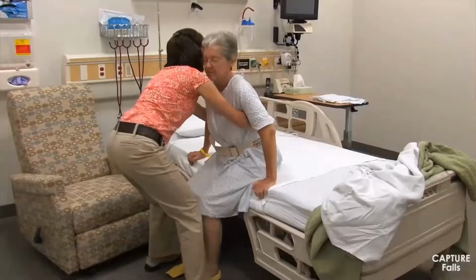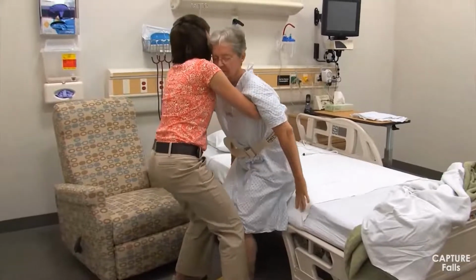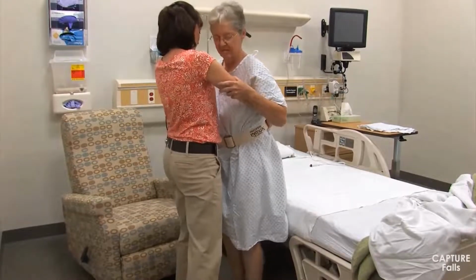The patient must lean forward to shift her center of mass over her base of support, which is in this case her feet, as she stands. I'm using the gait belt to guide the patient's center of mass forward. I'm not pulling straight up on the belt. Rather, I'm using it to help direct the patient forward and up on a diagonal.